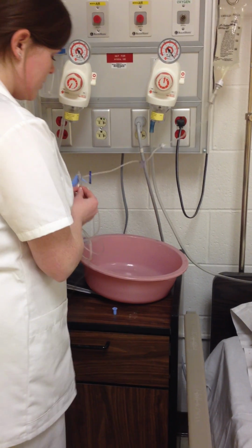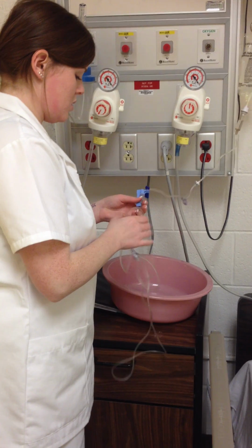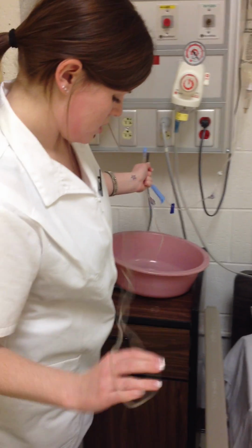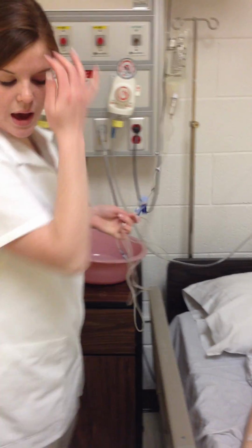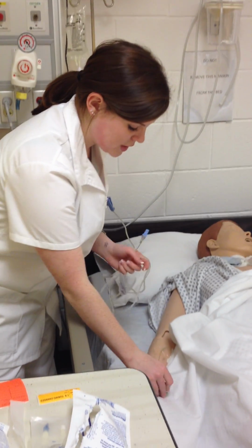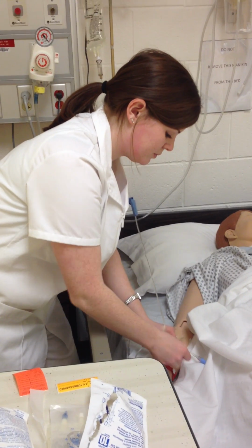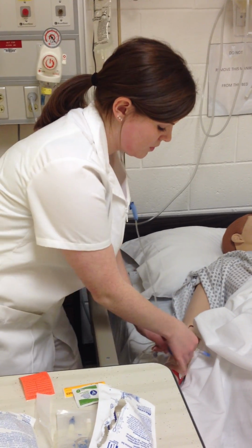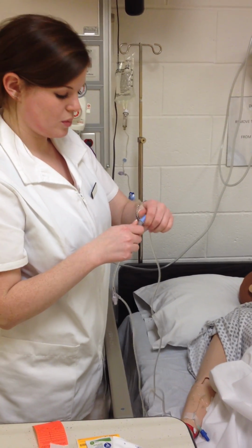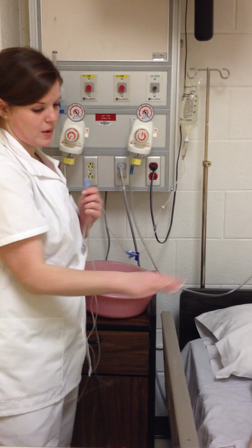Now the line is primed, I'm going to put the cap back on the tubing. And then I'm going to go and clean the heparin lock on the patient with an alcohol swipe. And then I'm going to insert the tubing into the port, except for the purpose of this validation, I'm going to use the basin so that it doesn't get wet.